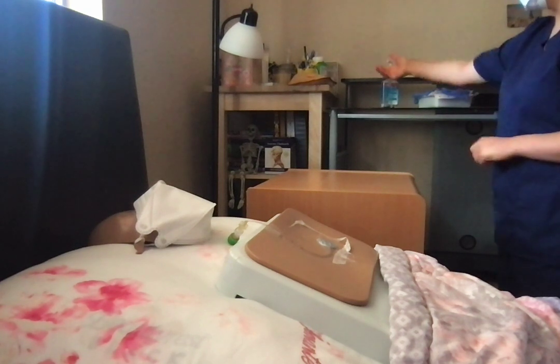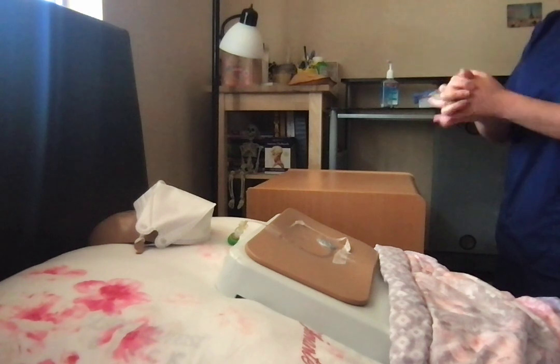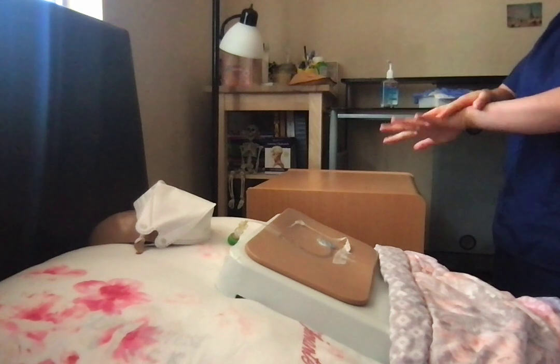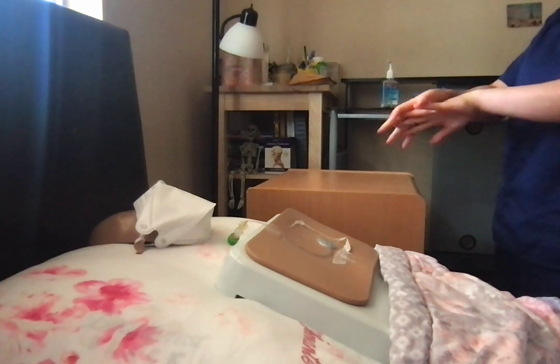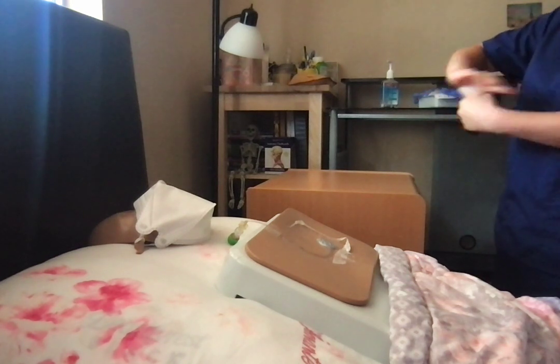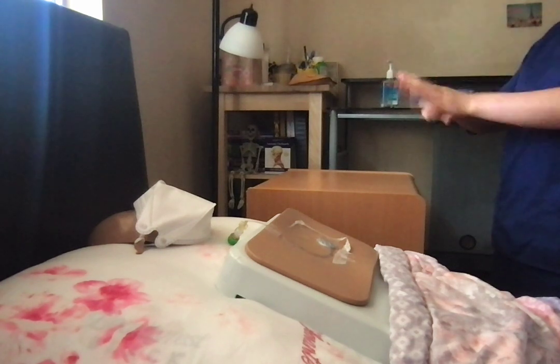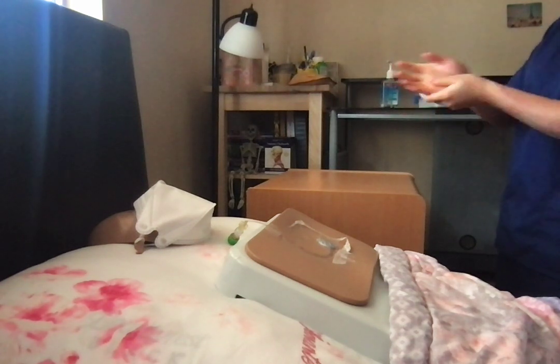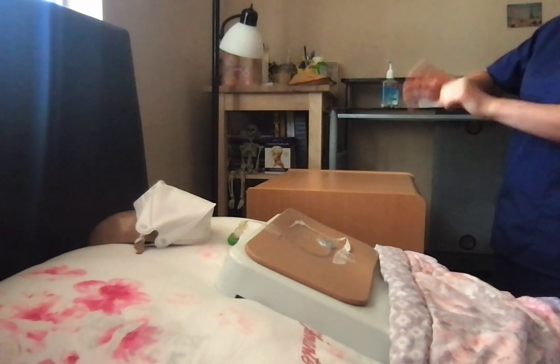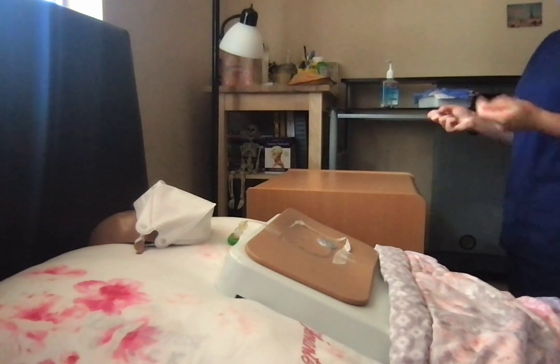So before I begin, I will perform 20 seconds of hand hygiene. And when was the last time you had this dressing changed — how did it feel? Did you feel any discomfort or pain? How did it go? It went well? Good. I cleaned my hands for 20 seconds.